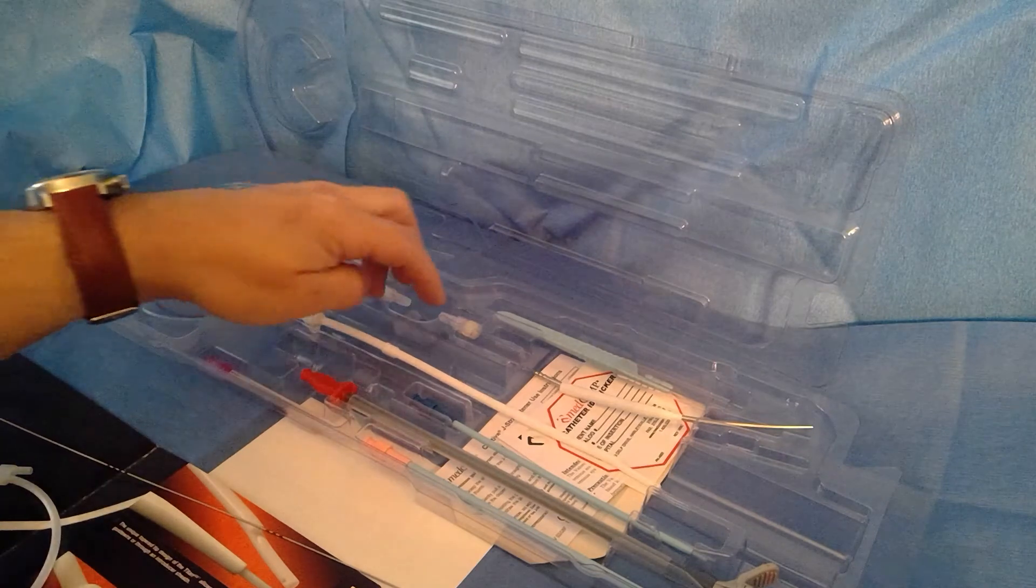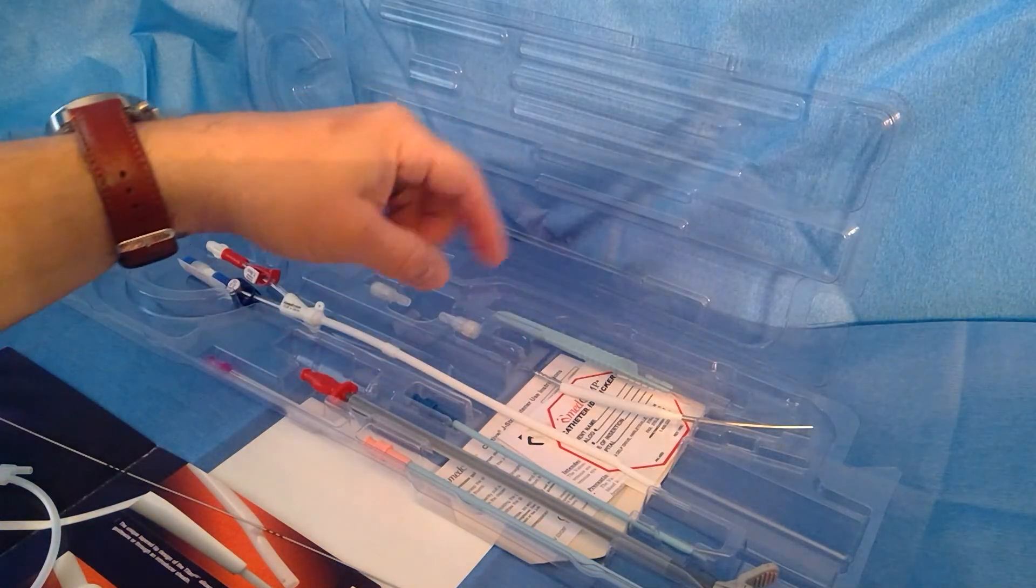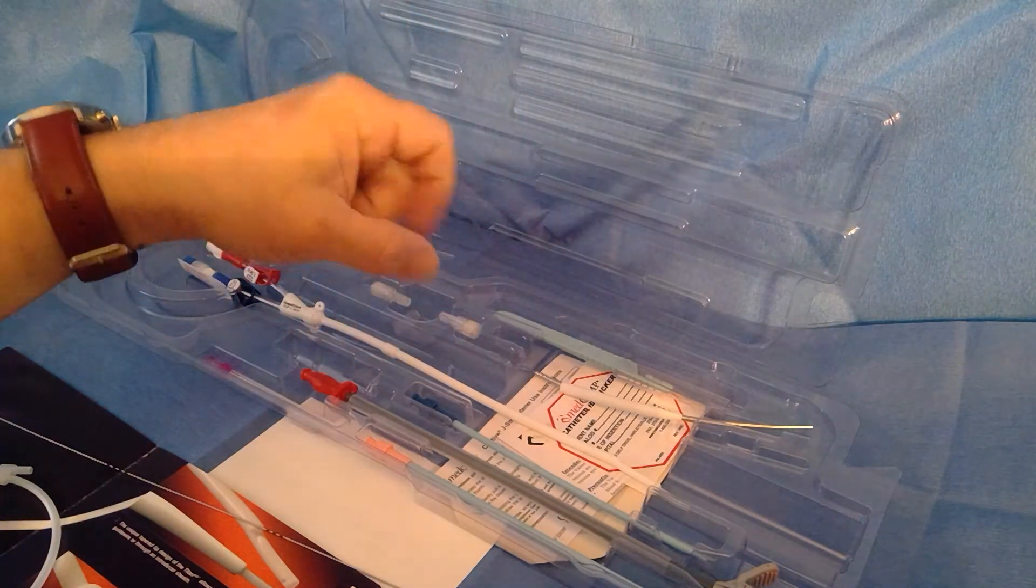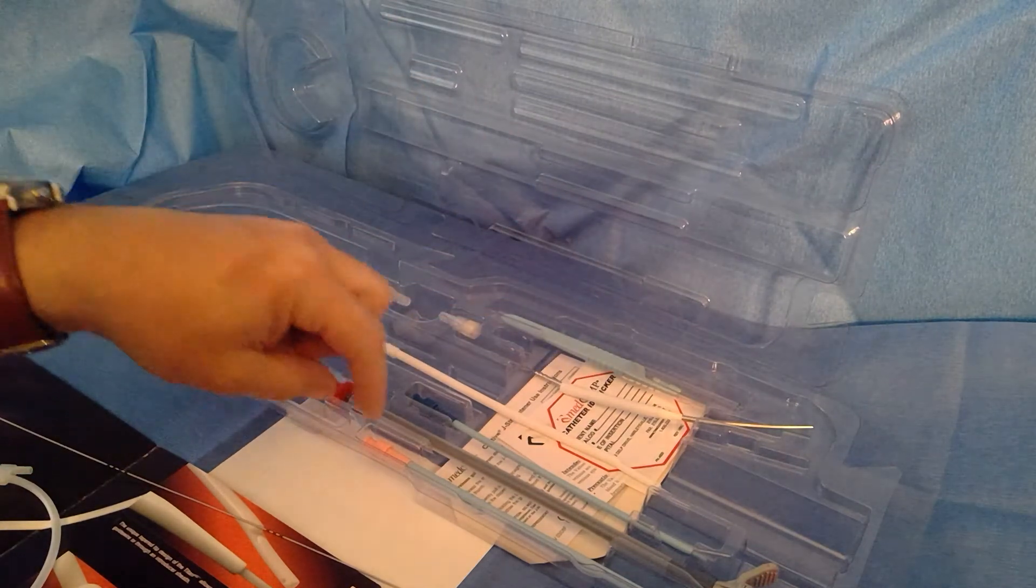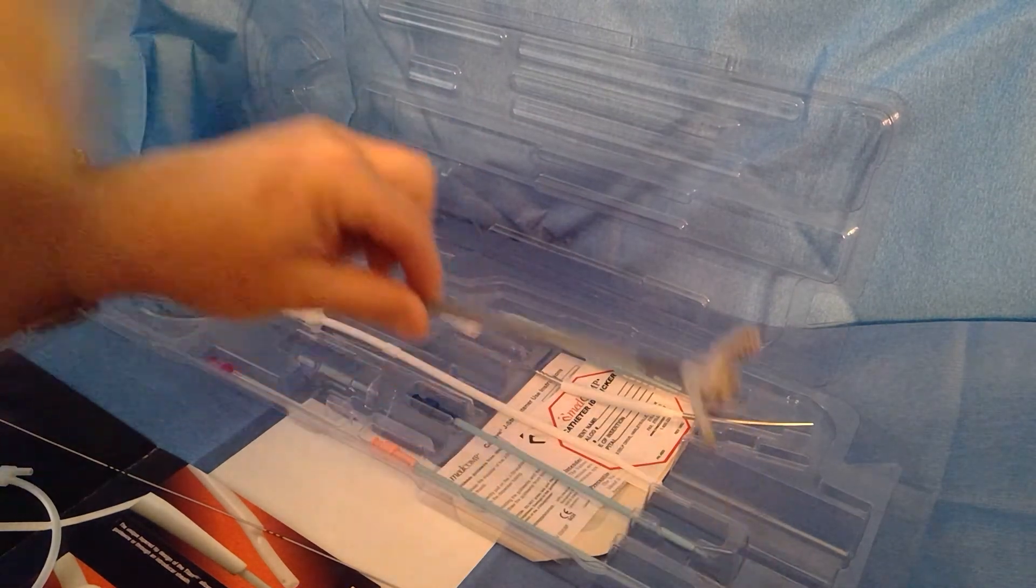It comes with your catheter, caps, tegaderm, your IFU and other information labels, scalpel, dilators, and then your air guard sheath.